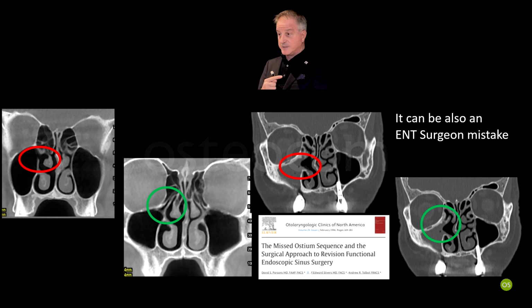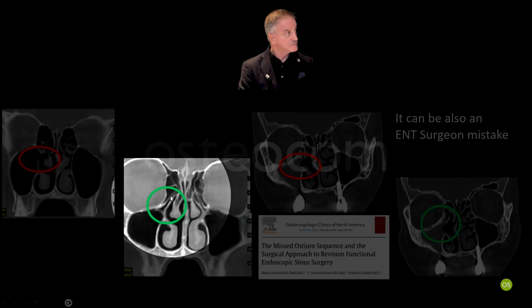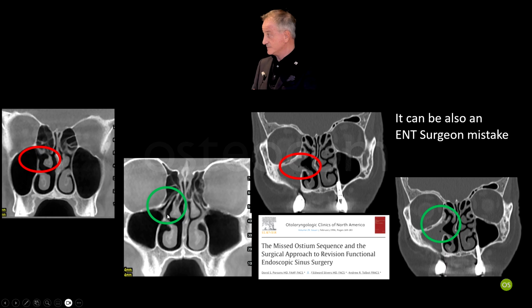I saw that opening, and immediately I know that is not the sinus opening. Why? The natural sinus ostium drains the mucus, 1.5 liters on average every day. Why? Because it's larger, and because there is not the uncinate process. The uncinate process is this one. The uncinate process guides you to the natural ostium.